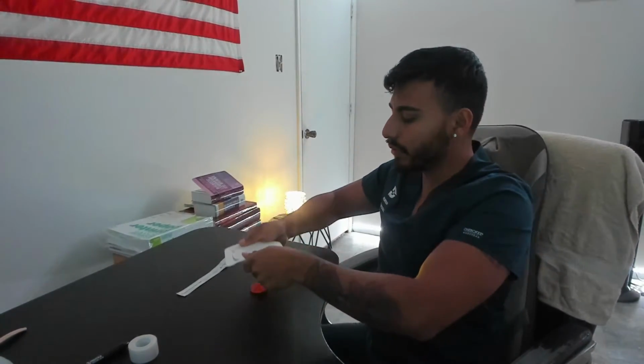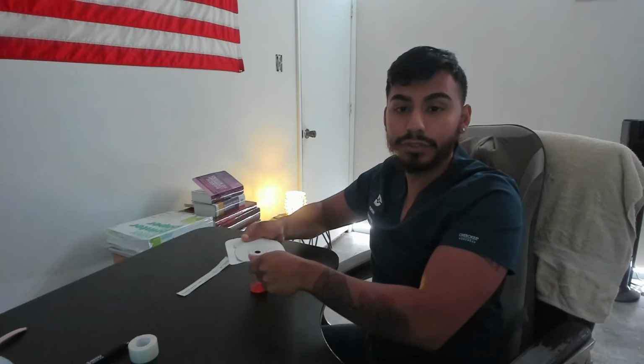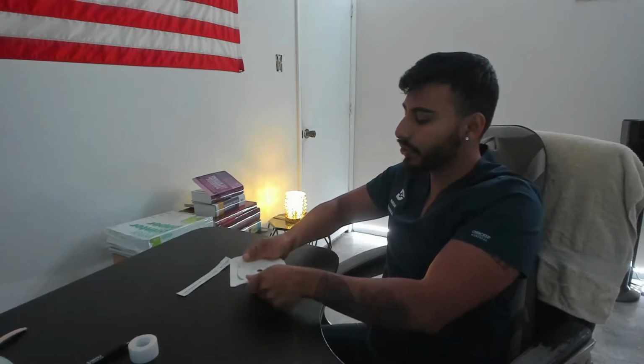But I would verbalize that with my measuring guide. I would hover over the stoma to see what measurement it is. I do not want to touch. I do not want the stoma and the measuring guide to touch each other. So I measure over it, and it is 45 millimeters.